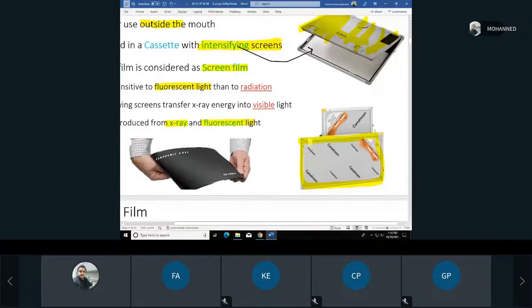Extraoral bite wings. Any of you have braces or done any? So what did they take? They took a bigger panoramic X-ray, right? Pano. So this is a panoramic one, and this one is cephalometric, which is technically the side of the face. They can take this in orthodontics, but not as often. And also when we are doing maxillofacial surgery, then they will take that.